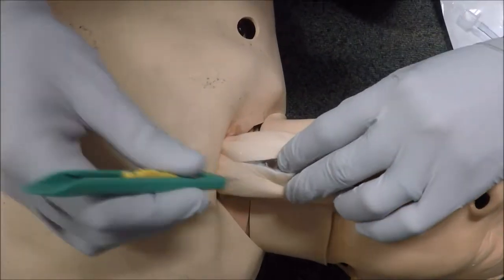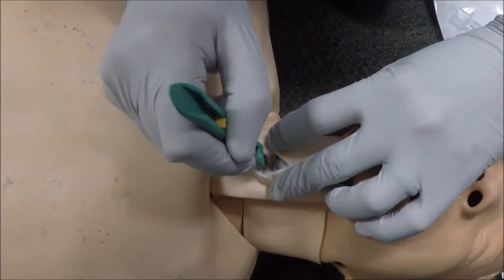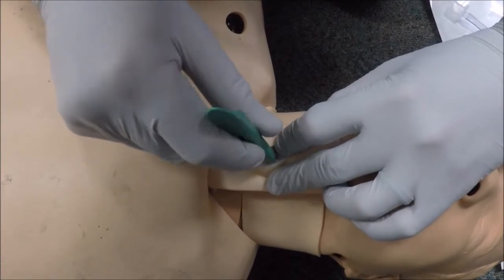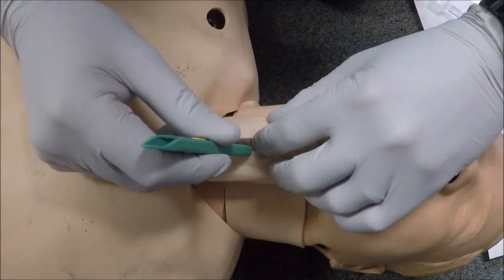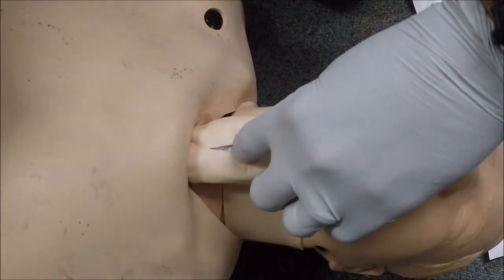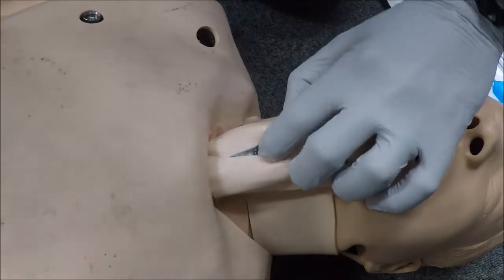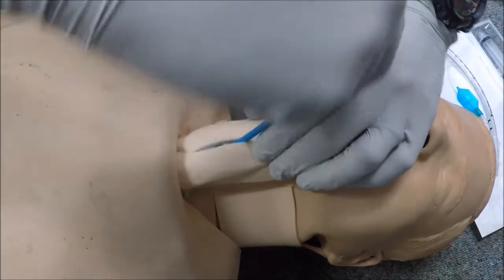So I've located my cricothyroid membrane. With the scalpel, I'll penetrate into the cricothyroid membrane, turn the scalpel and cut the other way, and then twist the scalpel sideways. One trick I did pick up from some of the FoamEd resources is this cartilaginous cage. So once you remove the scalpel, put your finger into the actual cricothyroid membrane and you can feel the cartilaginous cage, which will be confirmation that you're actually in the right anatomy. So once we've got our finger into the cricothyroid, we introduce the bougie into the trachea.